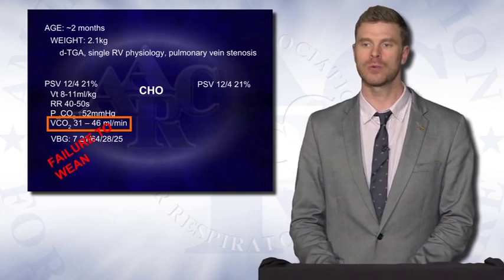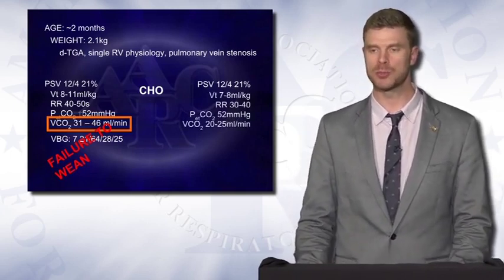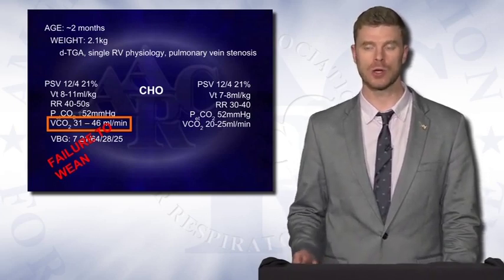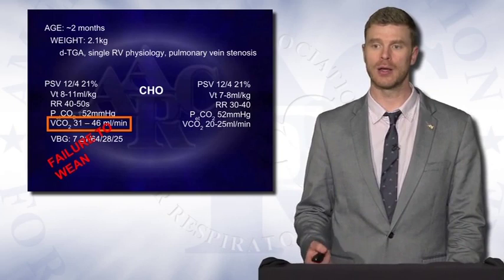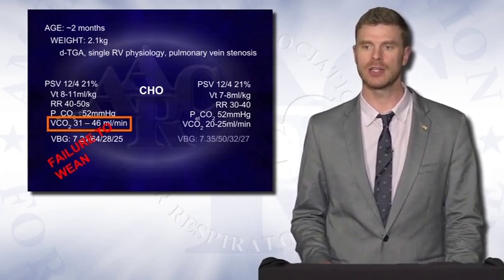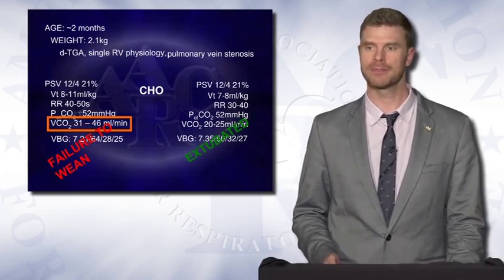So we cranked down the carbohydrates, and this is what we had. A much more reasonable clinical presentation. The patient's VCO2 decreased, which is what we hoped to accomplish, able to get them on lower respiratory rates, more reasonable tidal volumes, and started to ventilate even a little bit better. This patient was extubated and went on to do quite well.